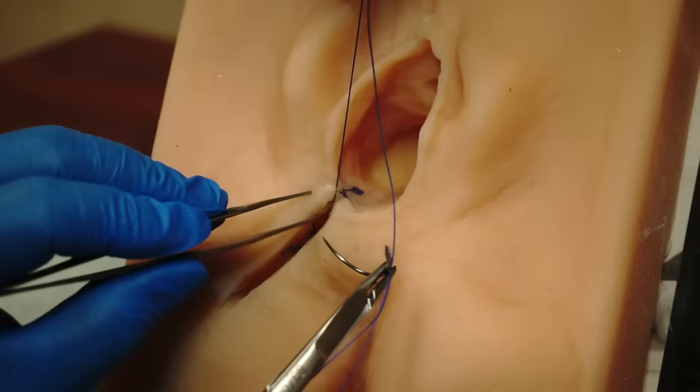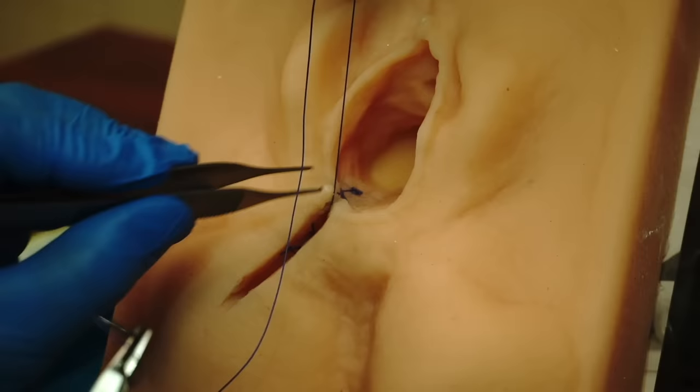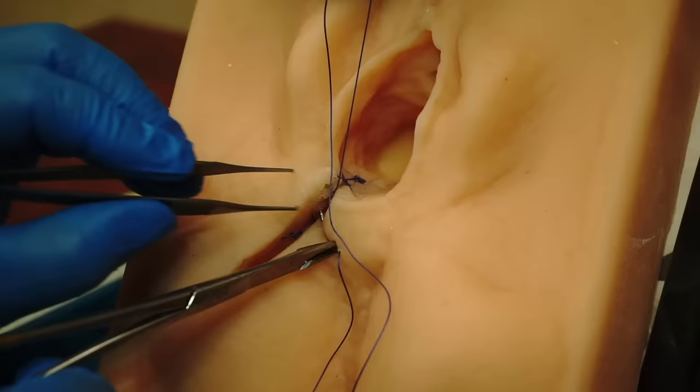In order to place a crown stitch, we go deep to superficial on the maternal right side, and then my hand will go on this side and we will go superficial to deep. In that way you actually bury the crown stitch into the posterior vaginal wall and there's no suture sticking out on the vaginal epithelium at the six o'clock position, which is so important for healing and for intercourse later on when the woman becomes sexually active.